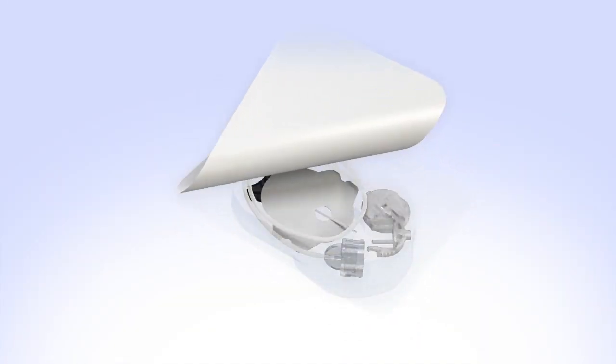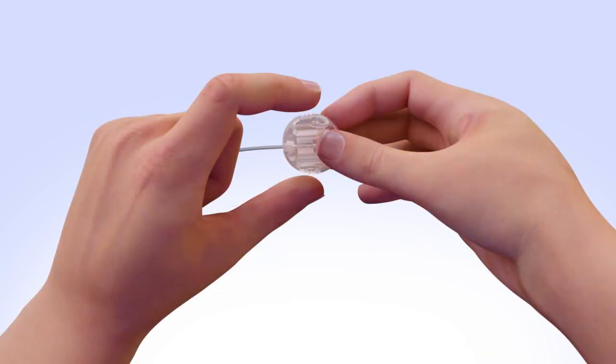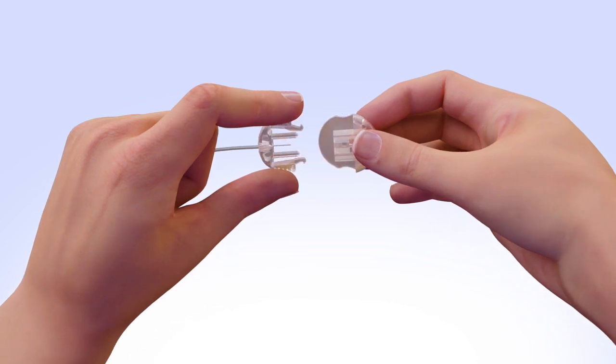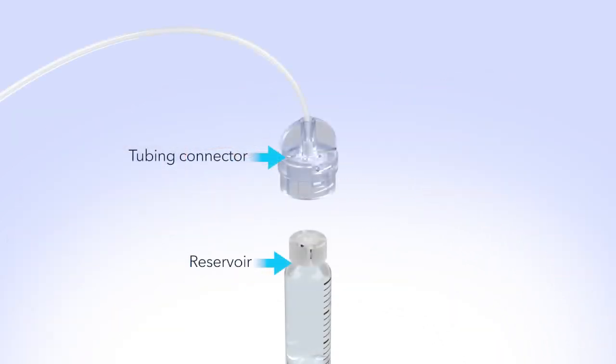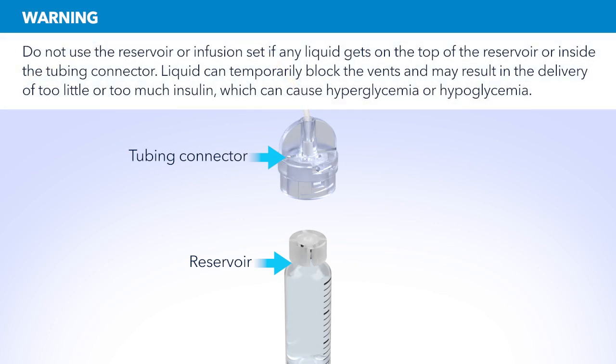Remove the infusion set from the package. Remove the protective cover at the end of the set release by gently squeezing the flexible arms on both sides and then pull it away to expose the connector needle. Make sure both the top of the reservoir and the inside of the tubing connector are dry before connecting them. Liquid can temporarily block the vents on the tubing connector. If any liquid has gotten on the top of the reservoir or inside the connector, start over again with a new reservoir and set.